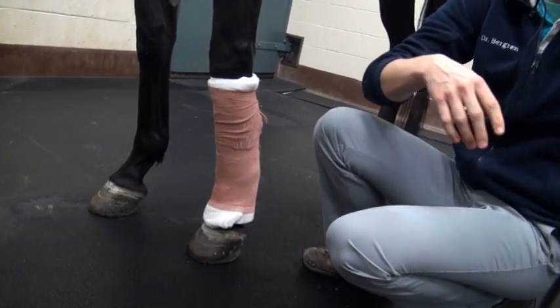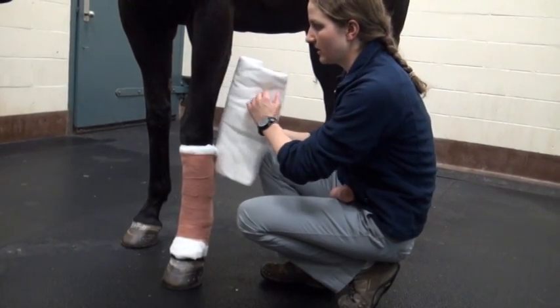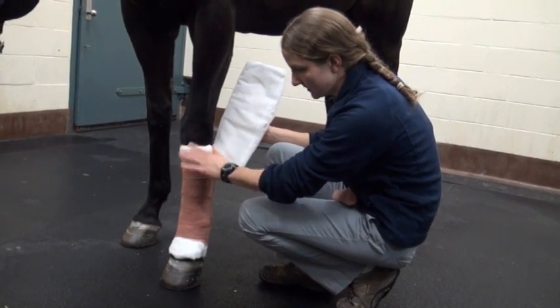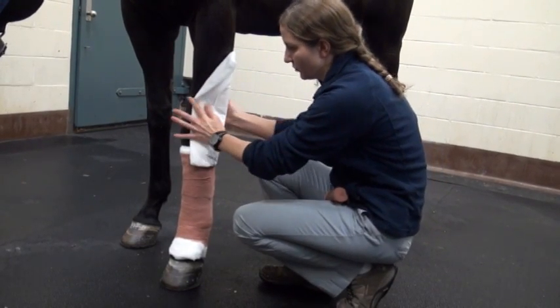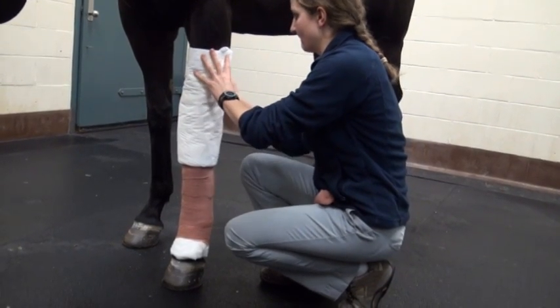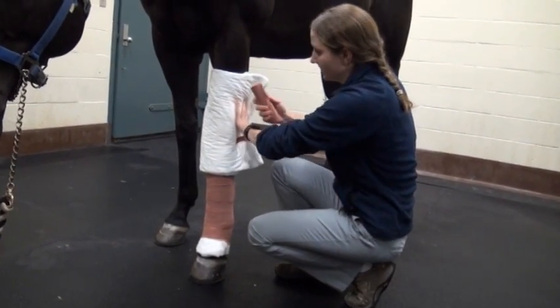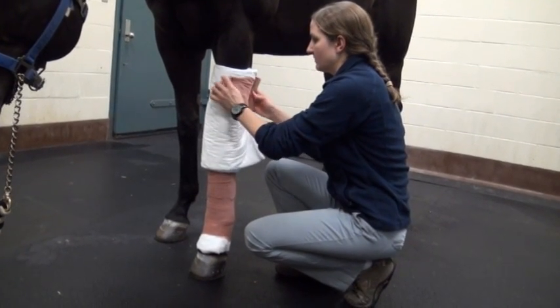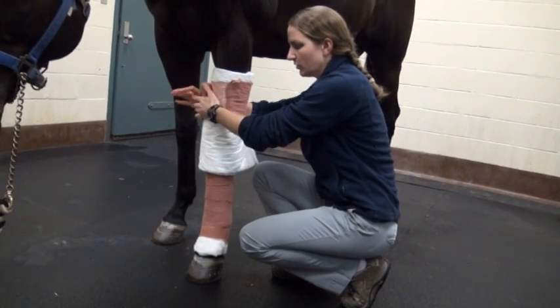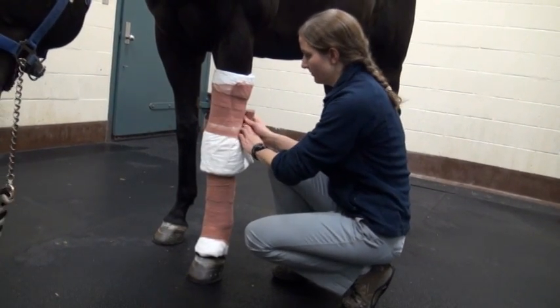If your horse is sent home with a stack wrap, you'll apply your distal limb wrap first, and then place a sheet cotton over the more proximal or upper portion of the limb. With this sheet cotton, you want to overlap your more distal or lower one by about 1 inch, and you want to apply your sheet cotton with even pressure. This is again overlaid with a brown gauze with a small amount of sheet cotton remaining out of the top of the bandage. And the brown gauze should be applied with firm, even pressure, putting pressure against the front of the limb and about 50% overlap with each layer.